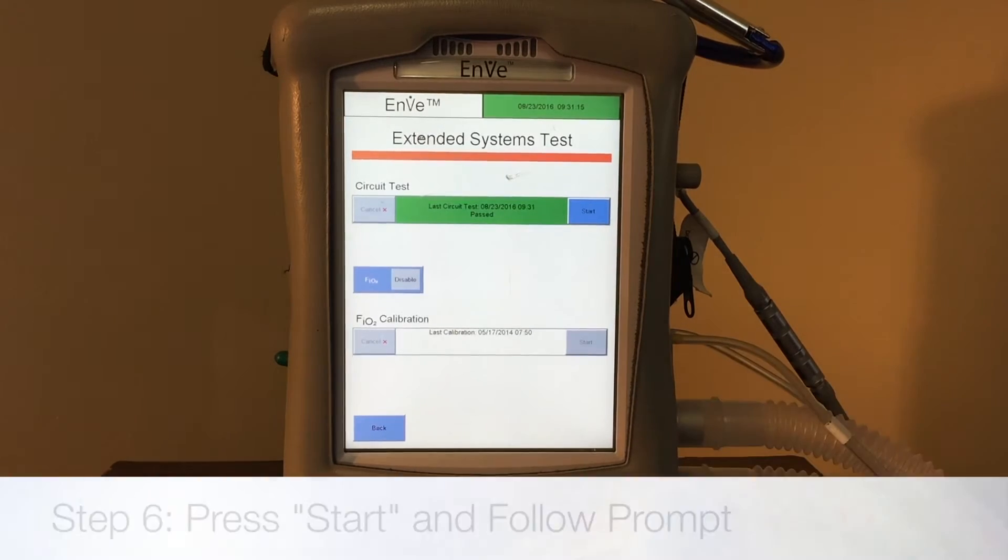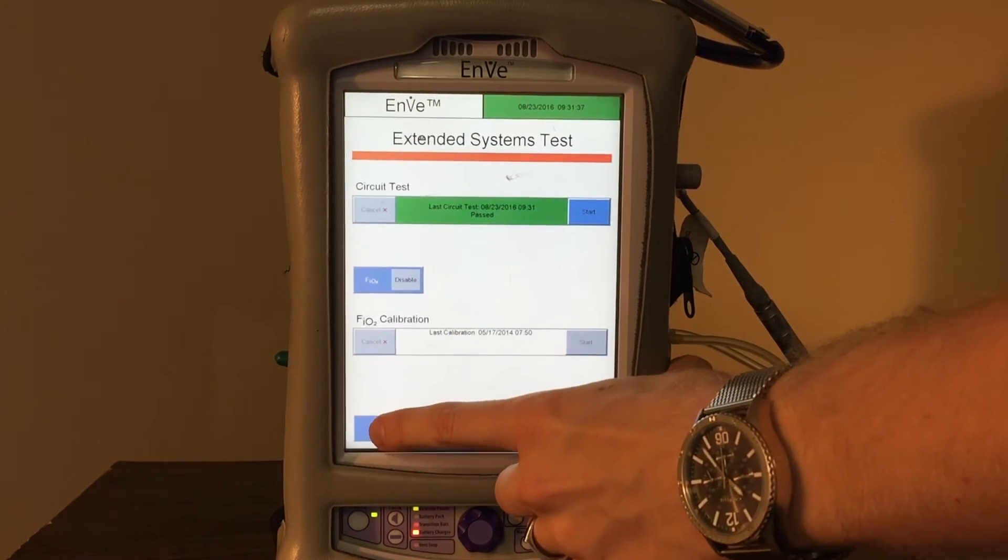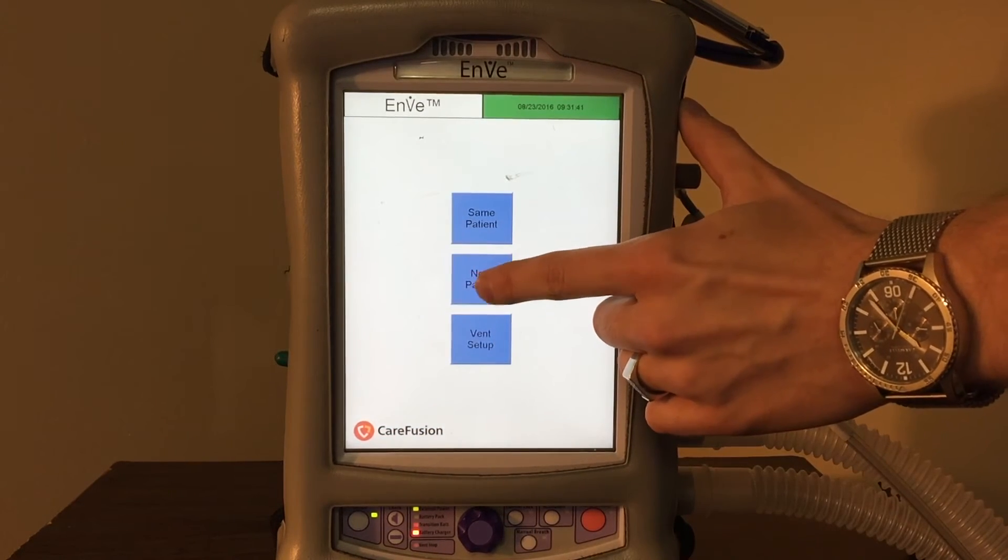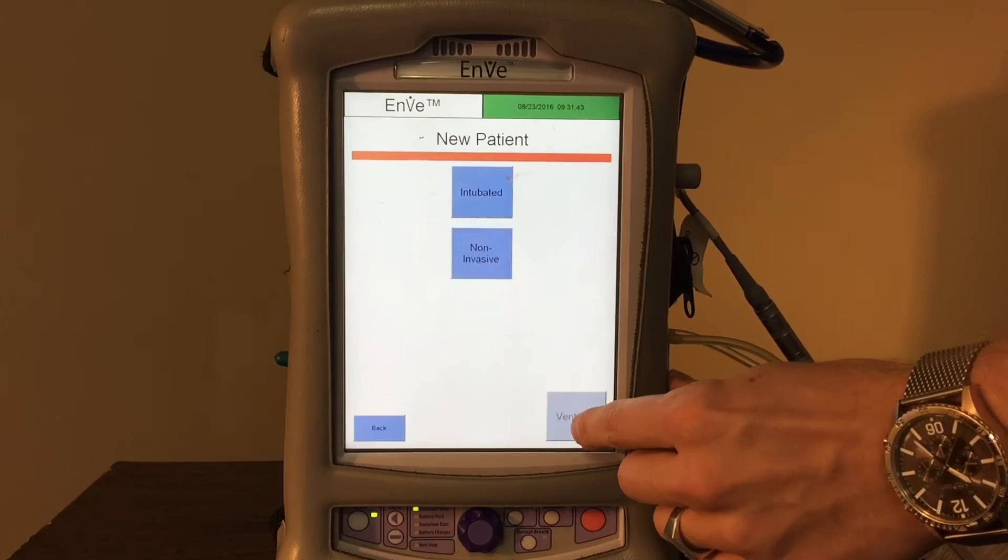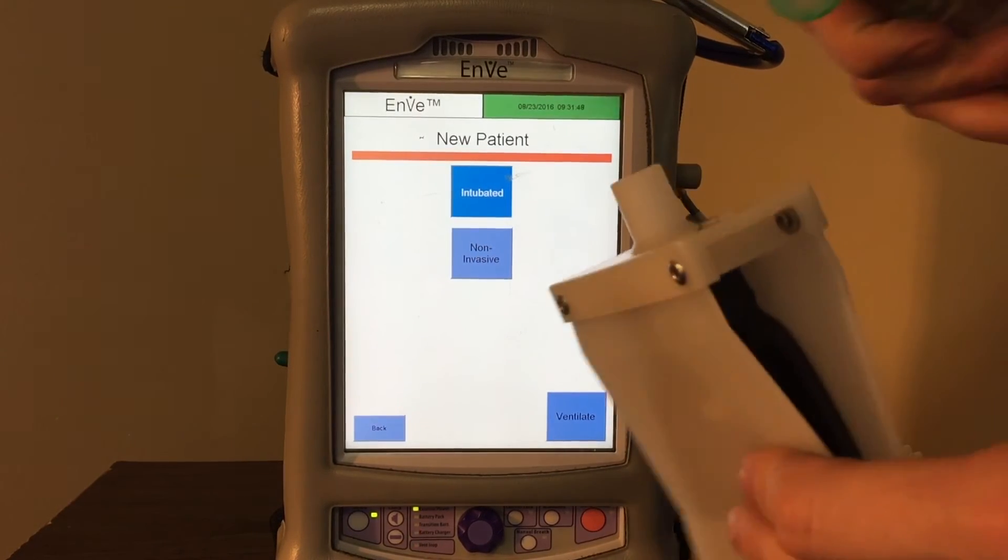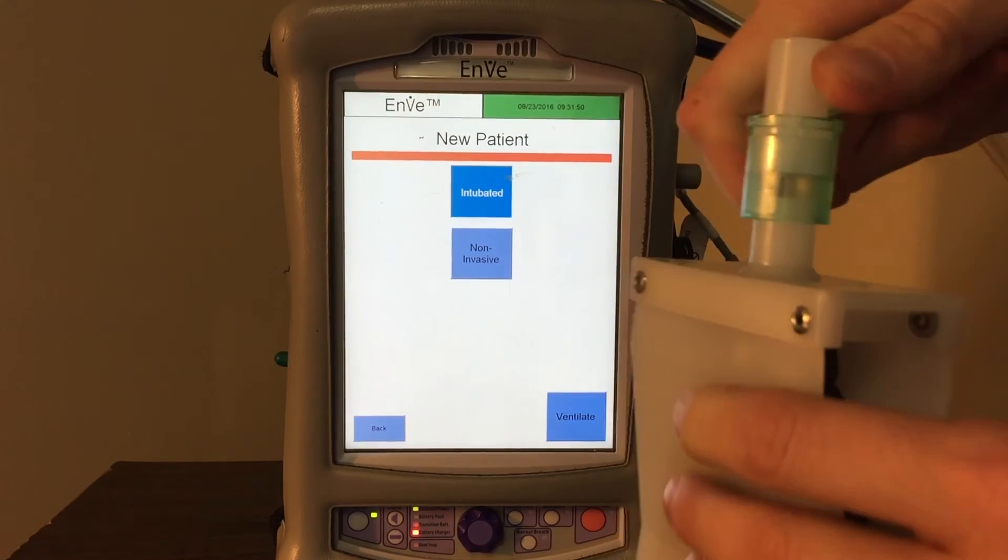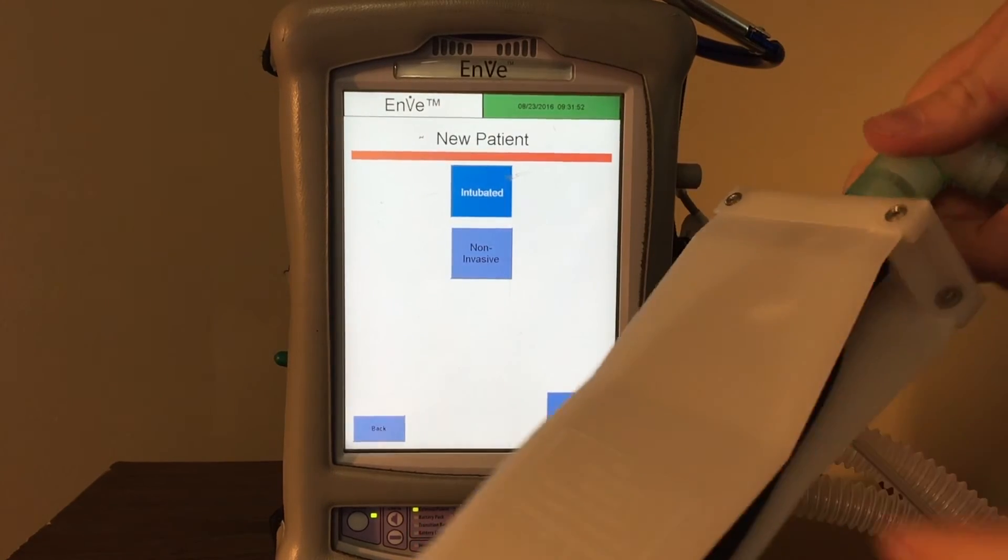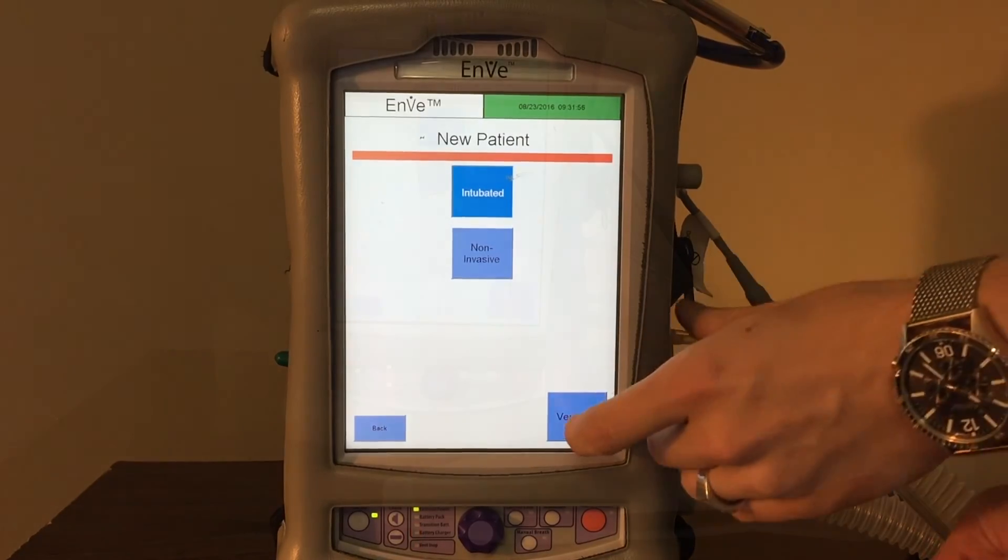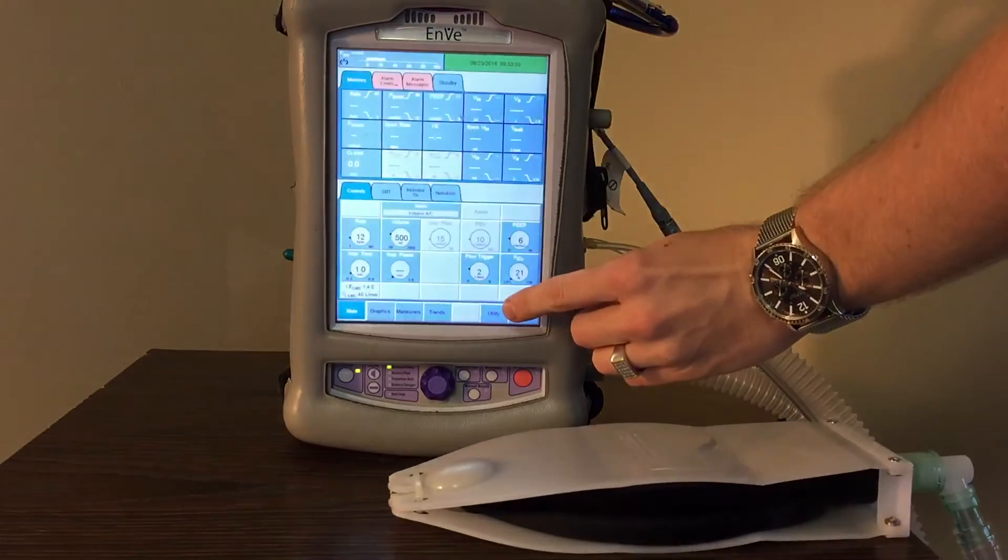So now we're ready to actually hook it up to a test lung. We're going to back out of here. We're going to hit new patient and then we're going to hit next and then intubated. And before we hit ventilate, we'll go ahead and take a test lung here and attach it. And once we hit ventilate, it'll start ventilating that test lung and that'll allow us to put settings in for our patient before we actually attach it to the patient.